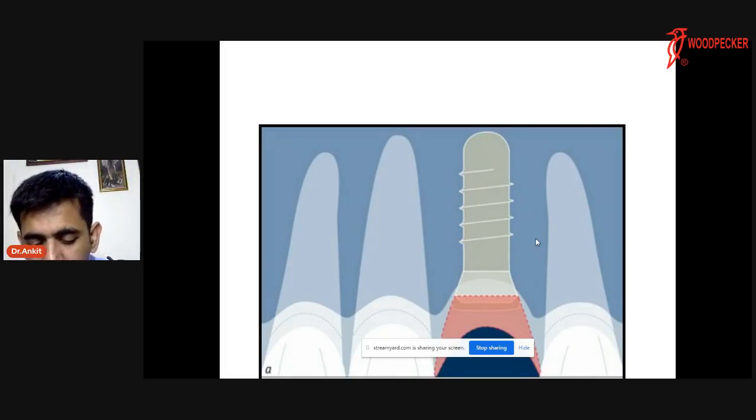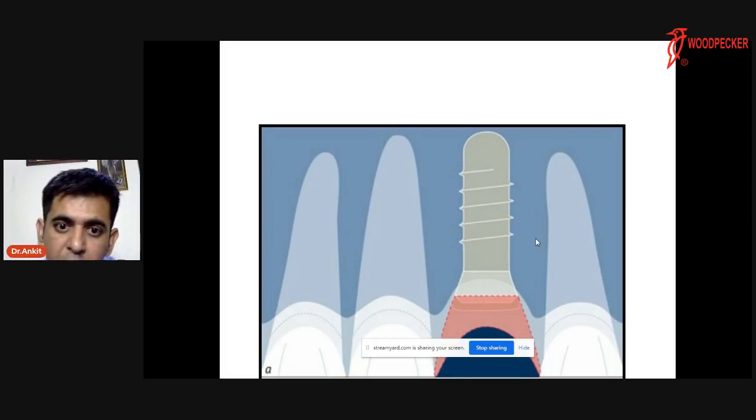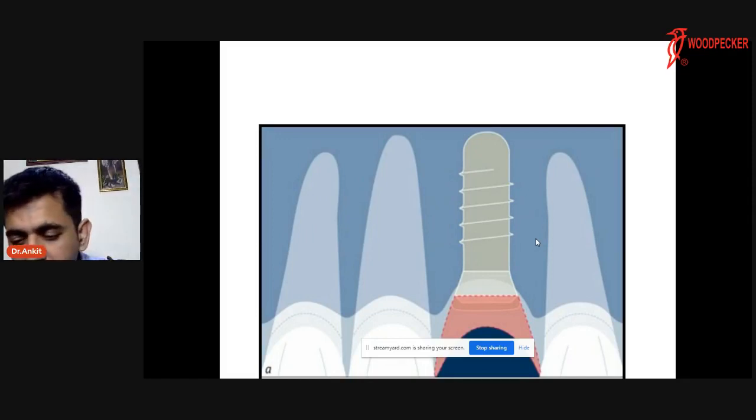At the same point of time, you can also understand that though the surgical procedure caused marginal bone loss to occur in the first year, what we appreciated after the 3 to 4 year time period is that the bone loss level was relatively stable after 4 years of the surgery, right? Okay, so let us move on to the other slides.